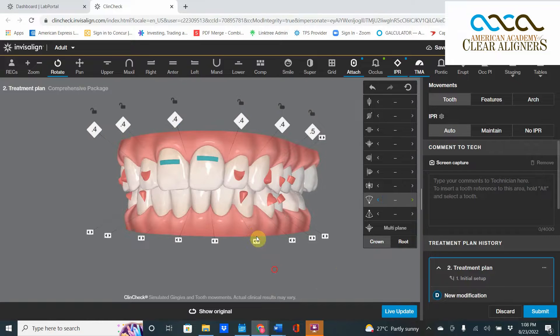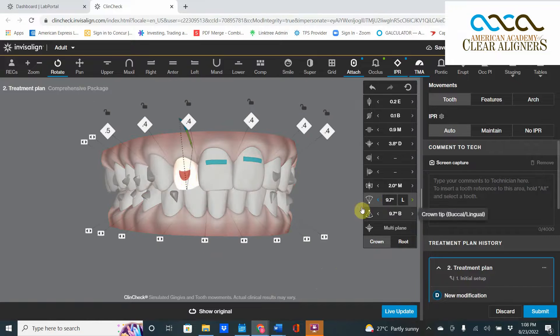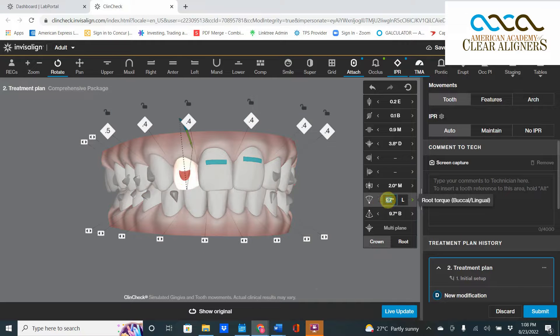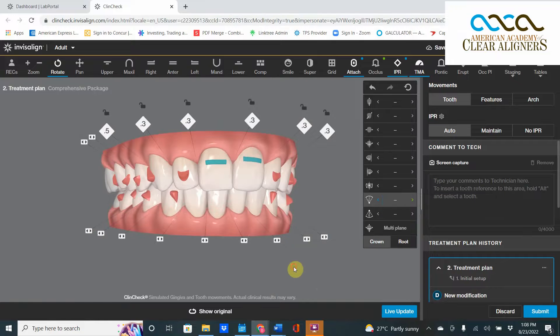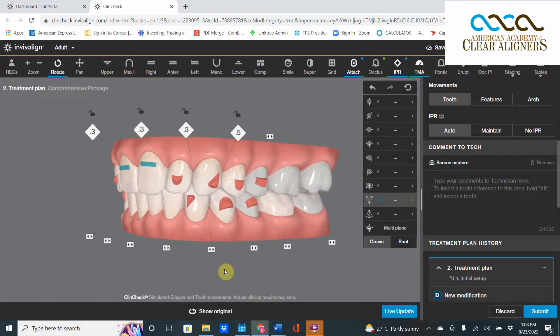Tooth 14, whoa that is so hard to do. I'm going to set you to zero. We don't need that movement. Going to set this one to zero. That button is the worst one. You don't ever want to see lingual root torques going on.